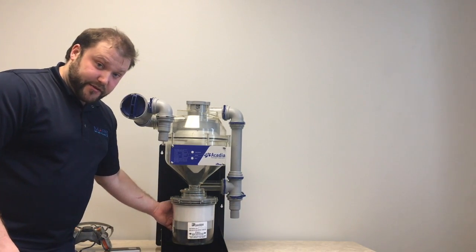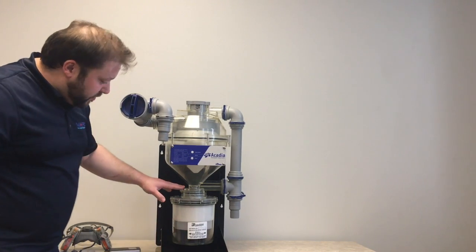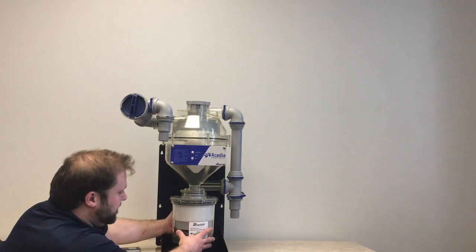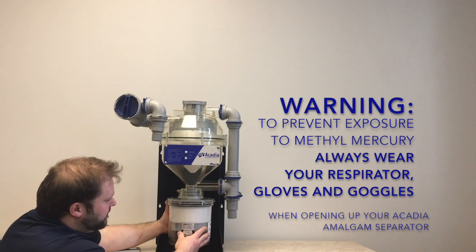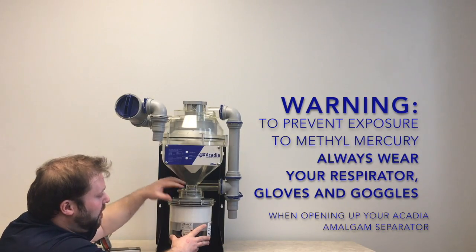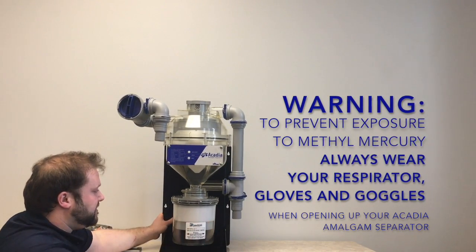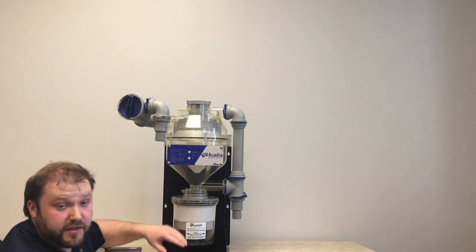You'll also be checking the filter. Now, if you've noticed the filter is not full, but your upper chamber has a little clog, don't worry. What the manufacturer suggests is leave your suction running. You can tilt the filter as such, just enough that air will get up into the upper chamber through the inlet here. It will jostle around what may have caused the clog, and then you just twist the filter back in, make sure to lock it in place, as so, and come back in a day and make sure that that issue has resolved itself.